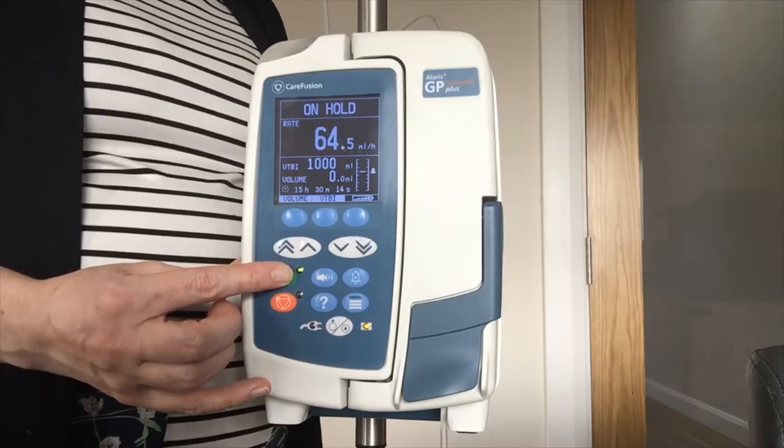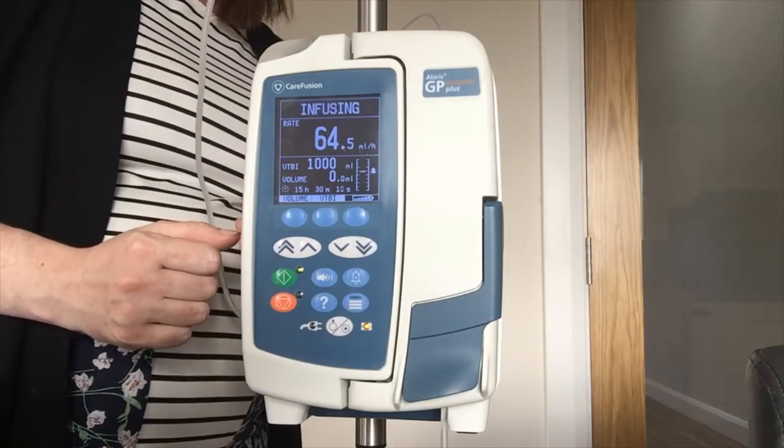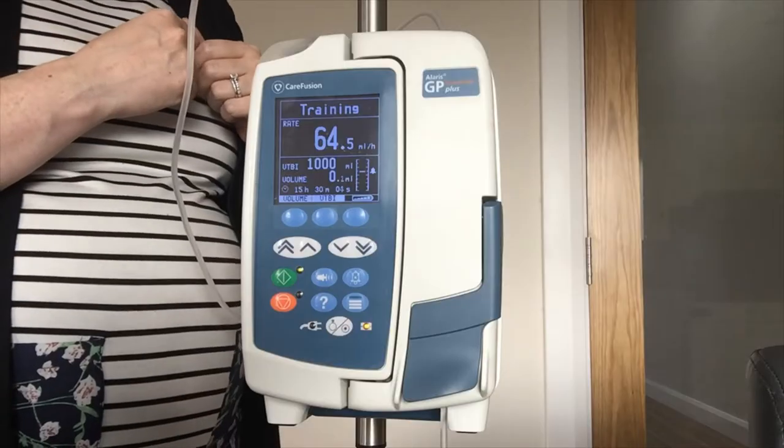My roller clamp is open. It is a traffic light system — green to run and orange if you need to put the pump on hold. I press my green key and the pump is infusing. I have my indicator flashing to tell me it is going and I have 'infusing' displayed across the screen, along with my rate, my volume to be infused and my volume infused.